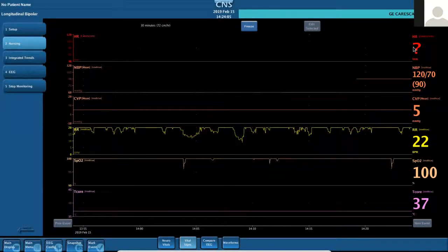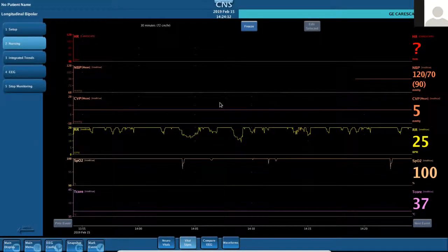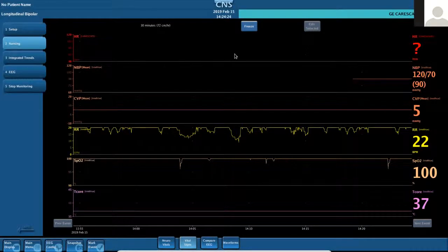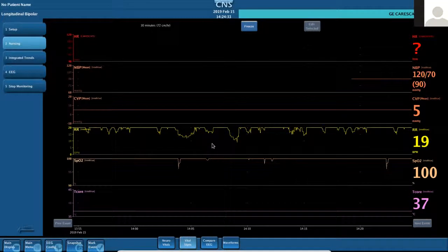So I'm just thinking that, like I was saying, there are some NICUs especially, and I'm sure this is happening in the adult world and PICU world as well, where the units are being retrofitted and changed and remodeled, and we're not always getting enough capital to switch out all our devices, or an isolation room ends up with the old ones. Exactly. And for cooling, people are changing from one type of cooling mattress, they might have 2 of something and 3 of something else. So I was just trying to think ahead for people about how to handle that.